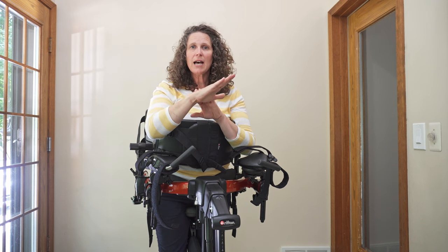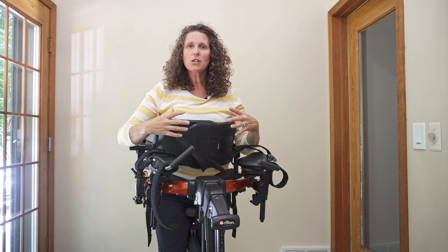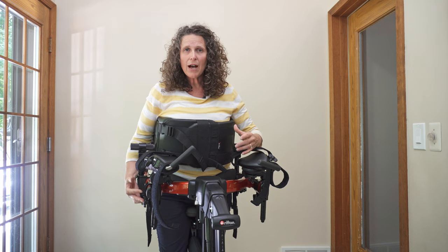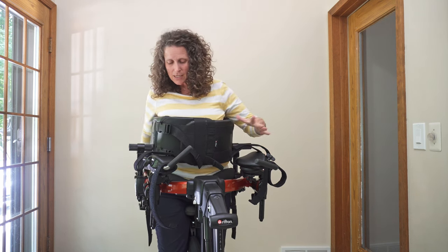When they're back here they tend to get a lot of pressure on their sacrum, so just be cognizant of that. Be looking for nonverbal cues for an individual who is nonverbal of how comfortable that is. So first, the pelvis — you can make that adjustment.